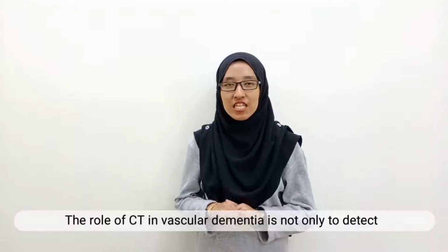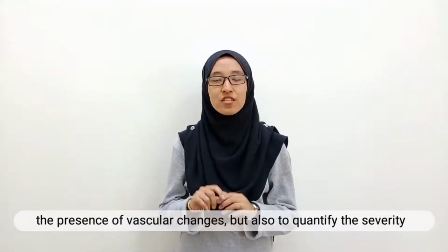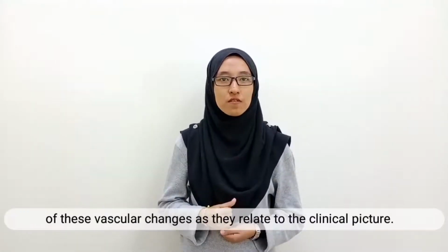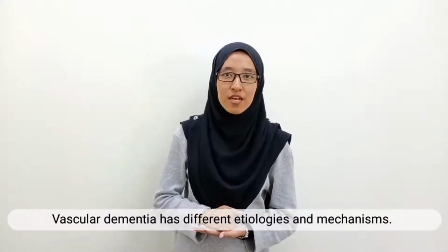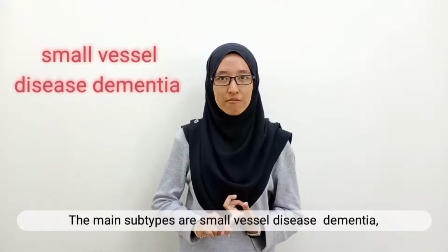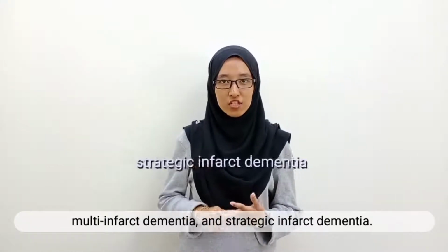The role of CT in vascular dementia is not only to detect the presence of vascular changes, but also to quantify the severity of these vascular changes as they relate to the clinical picture. Vascular dementia has different etiologies and mechanisms. The main subtypes are small vessel disease dementia, multi-infarct dementia, and strategic infarct dementia.